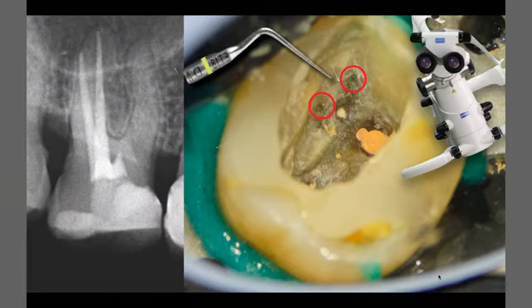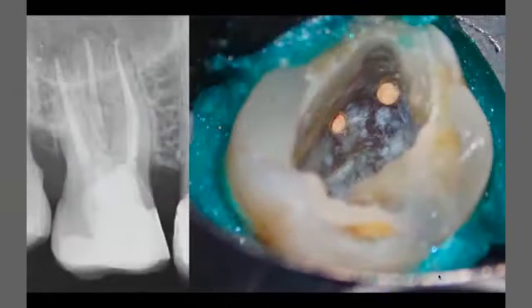Here it's very difficult to put your manual K file directly in the orifice. So I go directly with pre-flaring rotary glide path files just to open 1 to 2 or 3 millimeters of the root canal, then start negotiation with the manual files. It's very difficult to put your manual files directly inside this very narrow and calcified canal. After that, normal cleaning, shaping, and obturation. So I think I have finished.